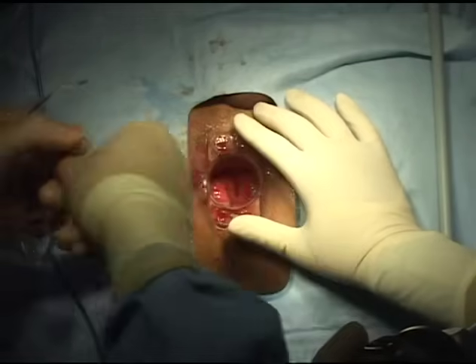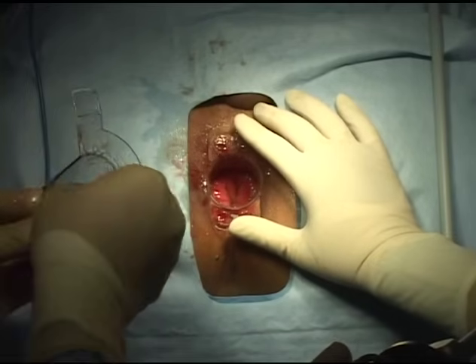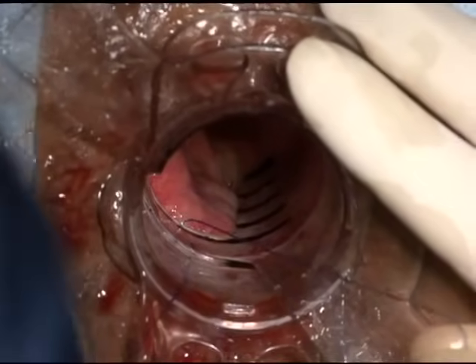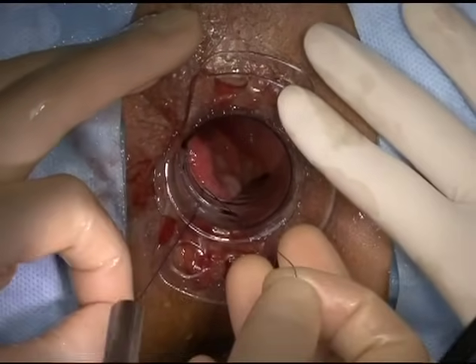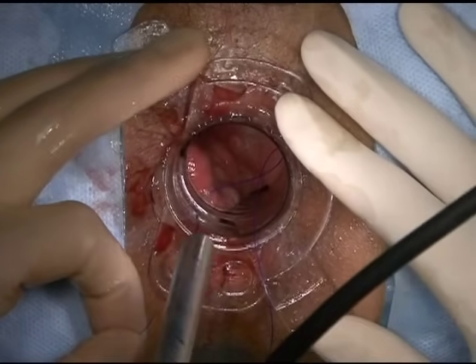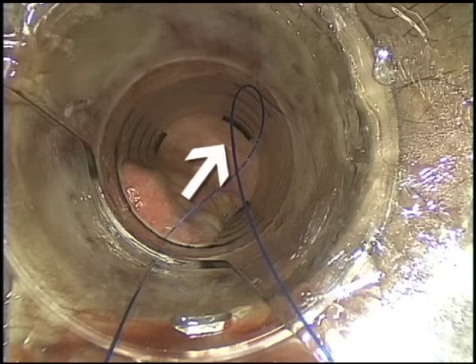Remove the suture from the package by grasping the needle with a needle holder. Thread the loose end of the purse-string suture through the open end of the anoscope, under the transparent bridge, and back over the outside of the bridge towards the opening. Attach a clamp to the loose end of the suture and place behind one of the anoscope handles and out of the way. The dilated anal canal and transparent anoscope enables the dentate line and underlying anatomy to be visualized.